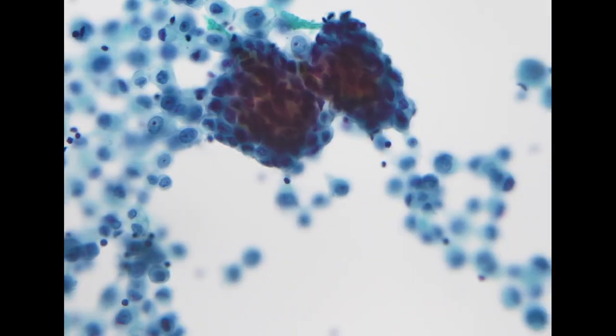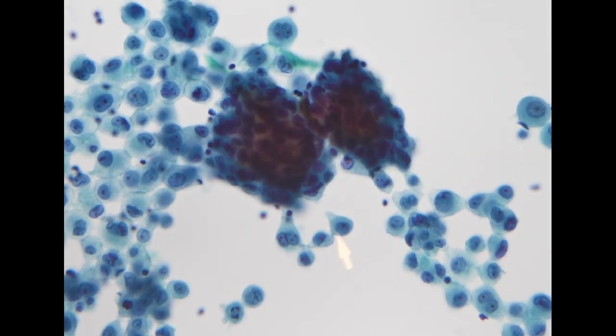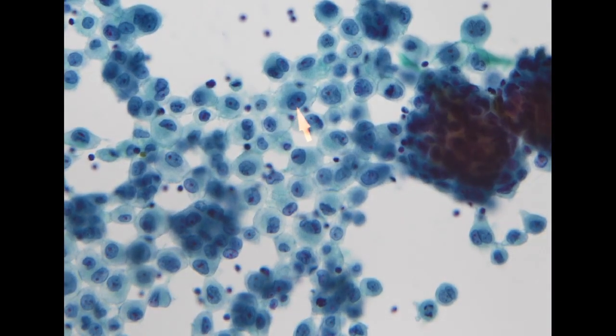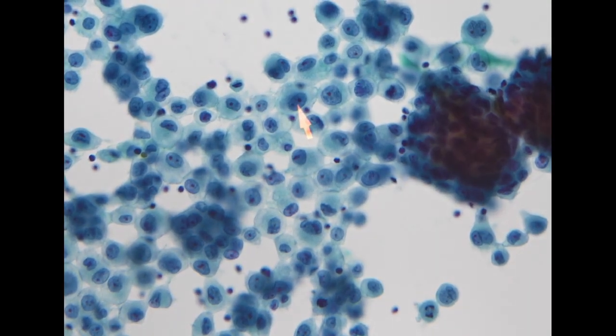and in the structure over here, the nucleus seems to be a little bit smaller than the adjacent larger mesothelial cell. So this looks a little bit different because this looks more bland, but this looks more typical.